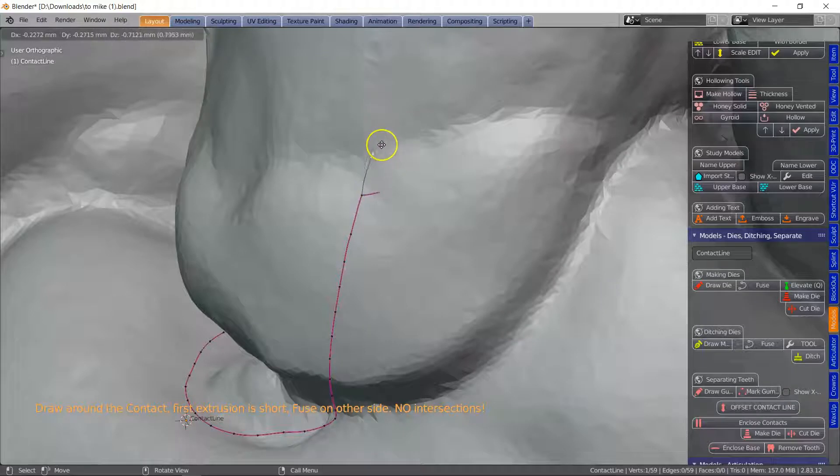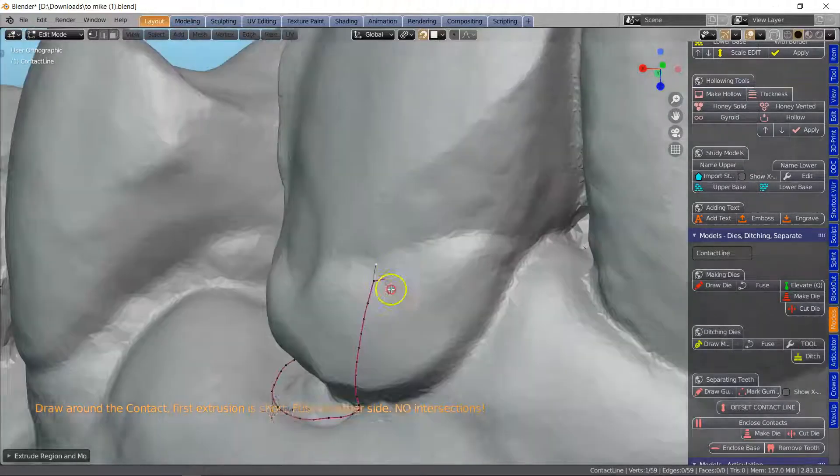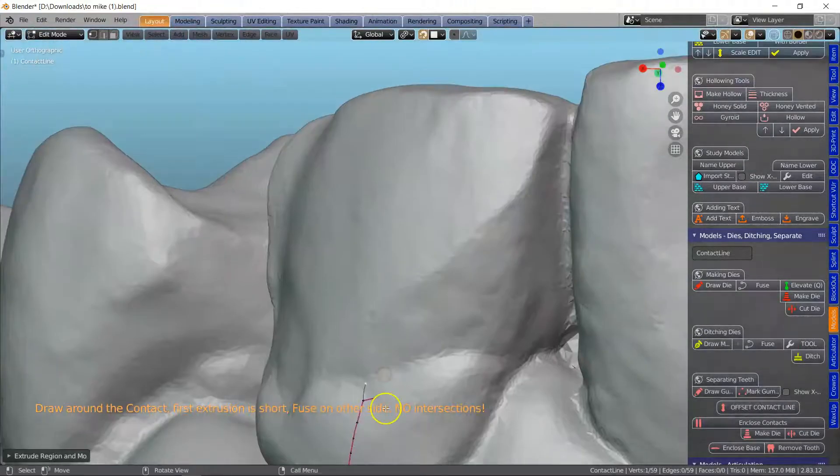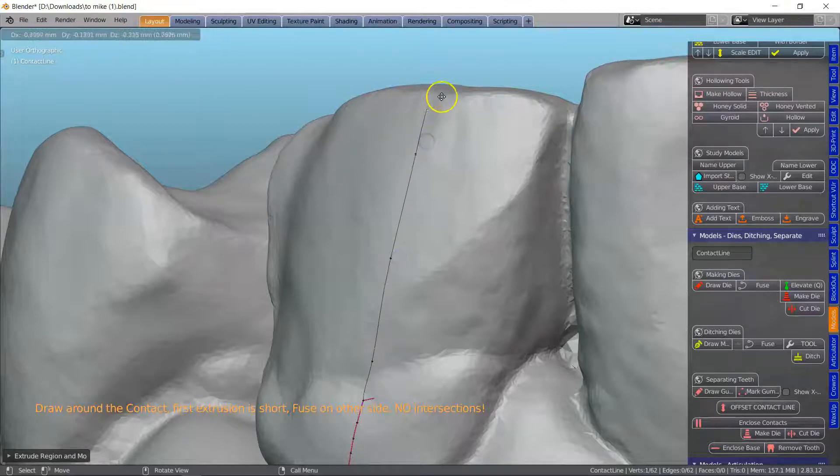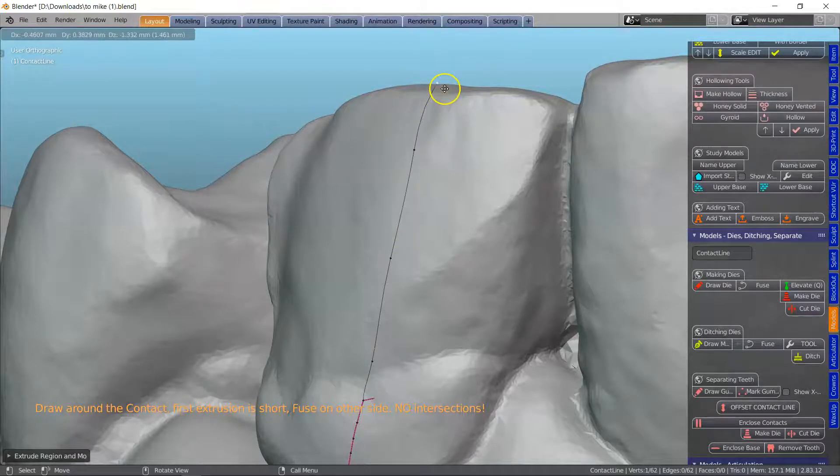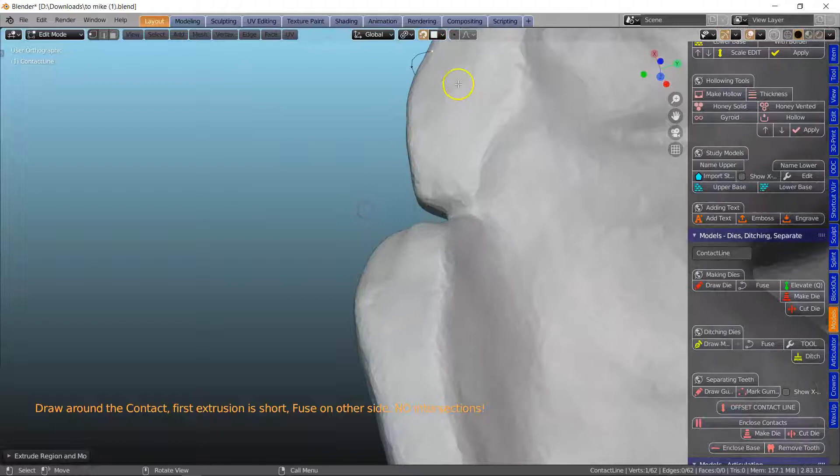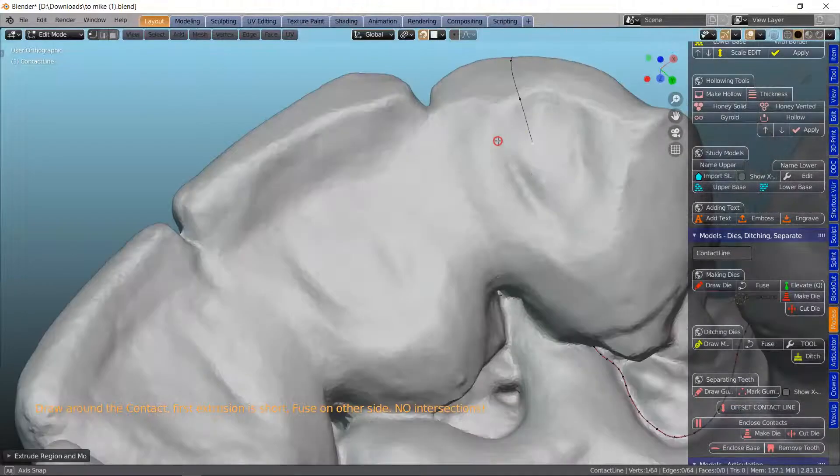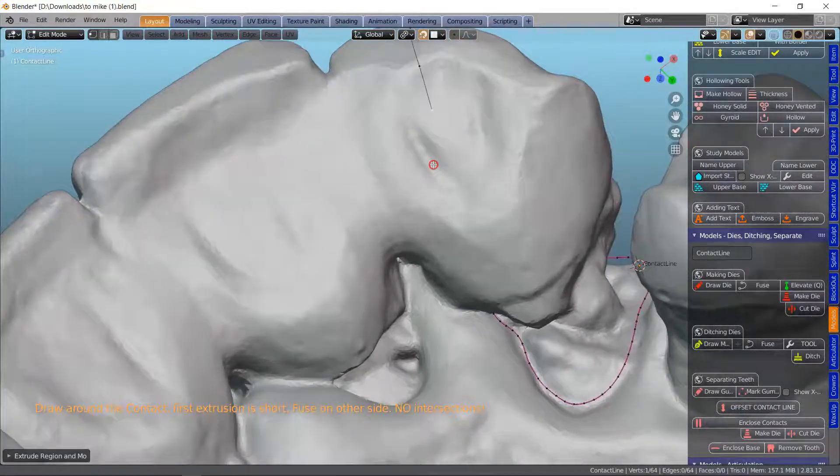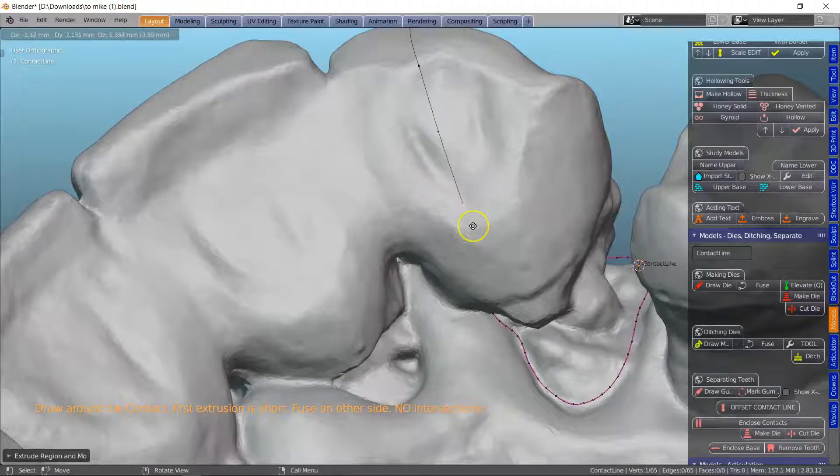the pink edge. So the first one we're just going to make quite short and the next one for the cutting tool can be quite a bit longer. Let's extrude this all the way. It's looking good.